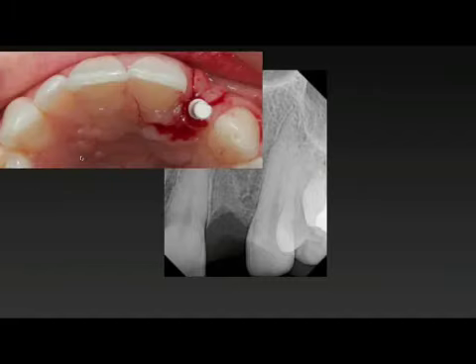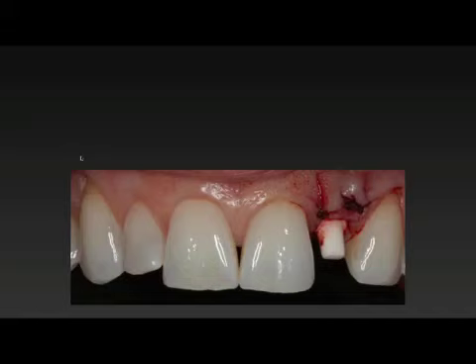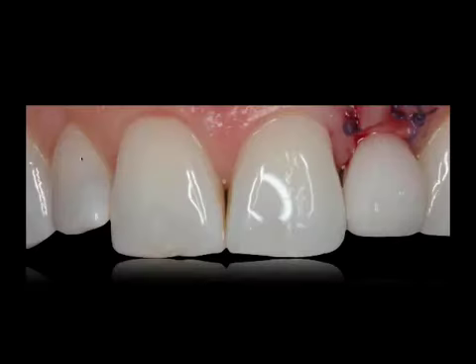This was the beginnings of the osteotomy and the insertion of a CeraRoot 1-2 implant. This was the image of everything flapped and closed and the implant in place with the final position of that implant. Now, in this case, because we had great stability and we had a great patient, we decided to immediately load or temporize this implant. And we created this provisional out of acrylic, and the patient left with that. Obviously, this was out of occlusion, no lateral contact, and with strict instructions for the patient not to load this.